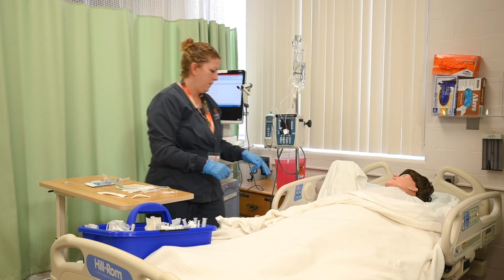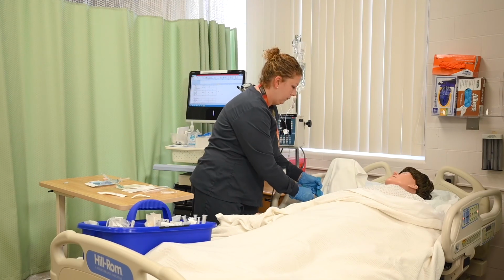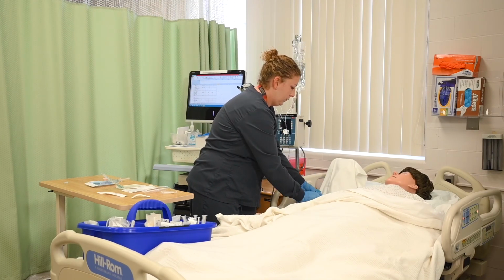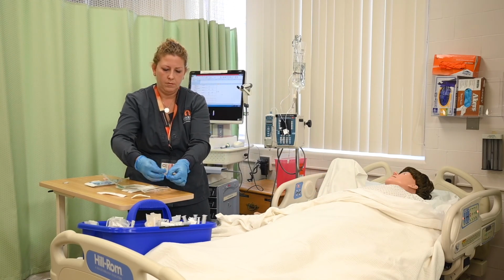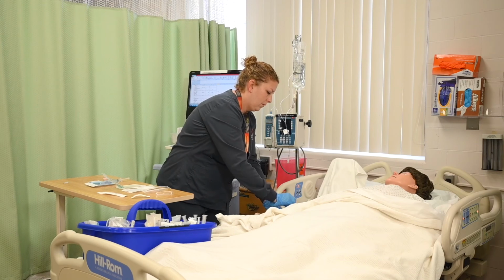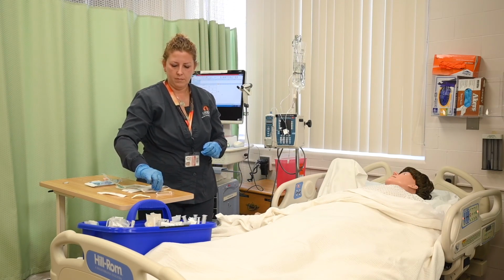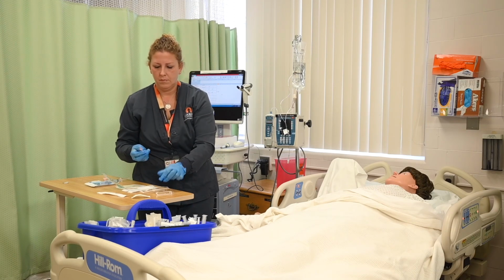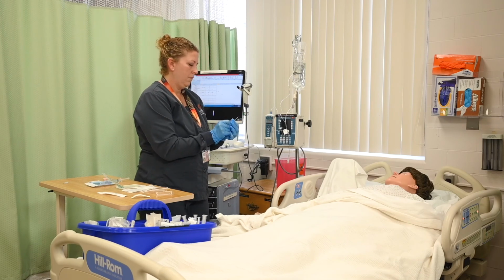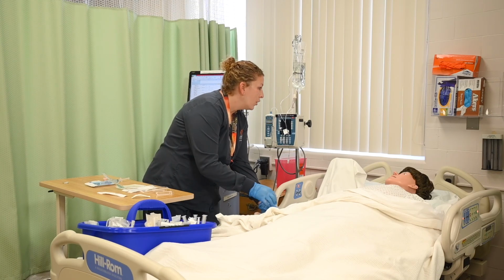Reapply the tourniquet 4 to 6 inches above the intended insertion site. Prepare the site with alcohol or other cleaning agent per facility protocol. Do not touch the insertion site after cleaning. Allow the site to dry. Stabilize the insertion site by applying traction distal to the site. Warn the patient of a quick stick. We're going to feel a quick poke.